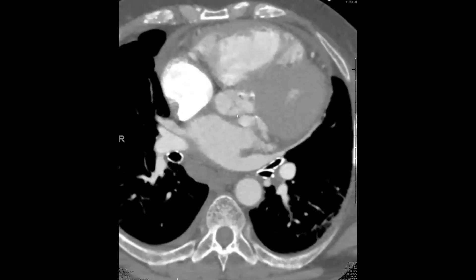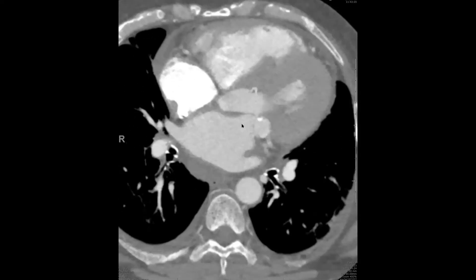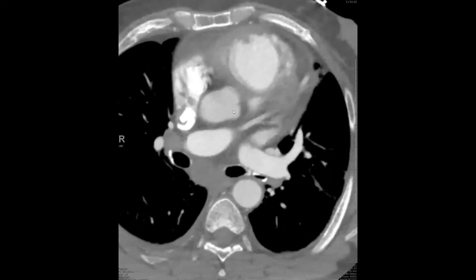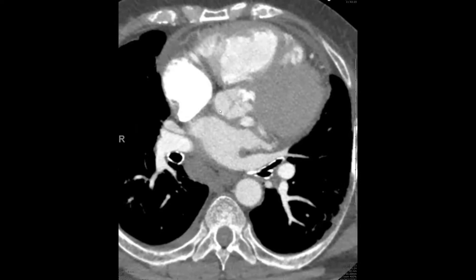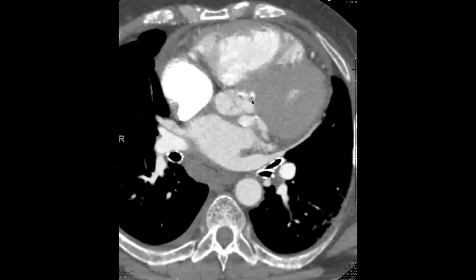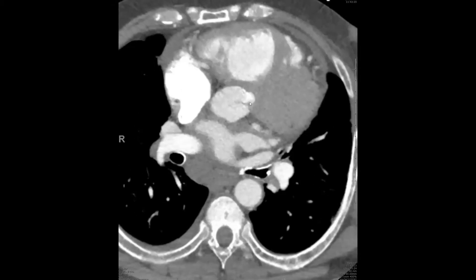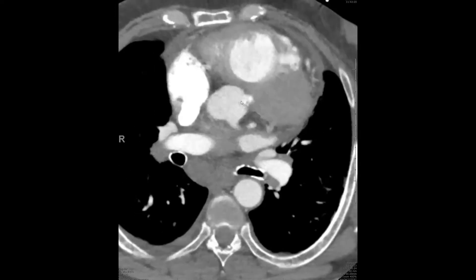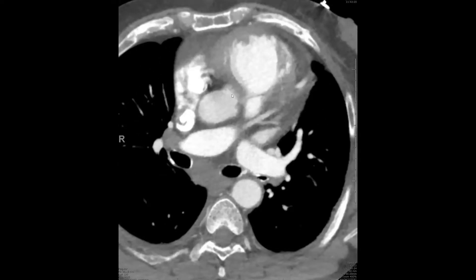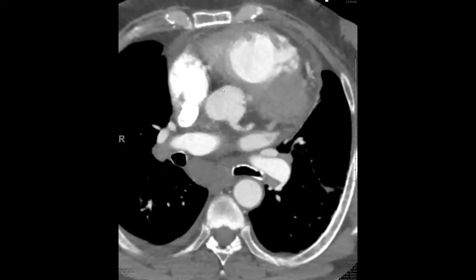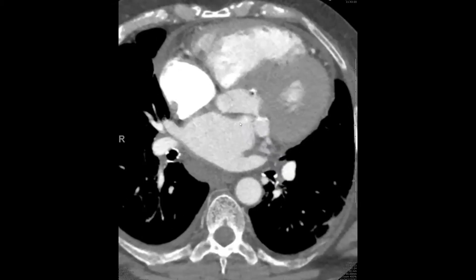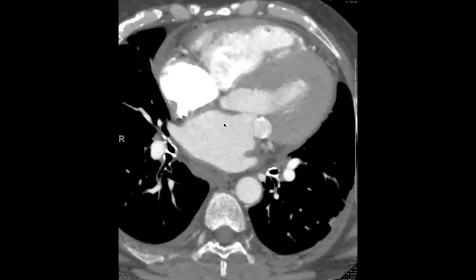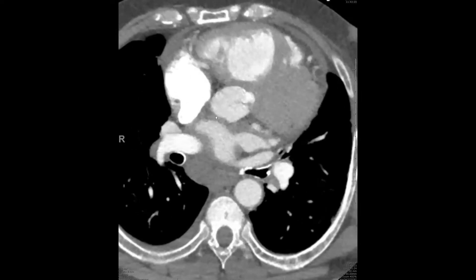Remember, the mitral valve and the aortic valve are actually in fibrous continuity. As we scroll a little bit more superiorly, we see another focus of hyperdensity, a little bit different from the blood pool — a chunky area of calcium that looks like it's associated with the right coronary cusp, but probably also the left coronary cusp. Here's the right coronary artery — there's some motion artifact even though this is an ECG-gated study. Here's the right coronary cusp, and here's the left coronary cusp. I would wonder if maybe there's a pseudoaneurysm here.